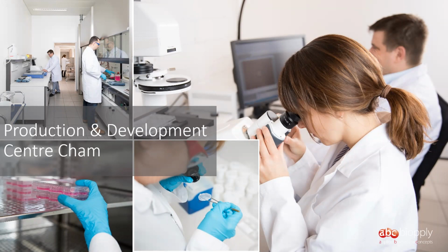The reason is that in order for the cells to grow at the bottom of each individual microcavity, they must not attach to the sides and the walls of the microcavities. The chips have been designed such that no cells can ever attach to the side walls. However, as soon as I start coating those chips, I would lose that advantage and cells would simply grow everywhere.